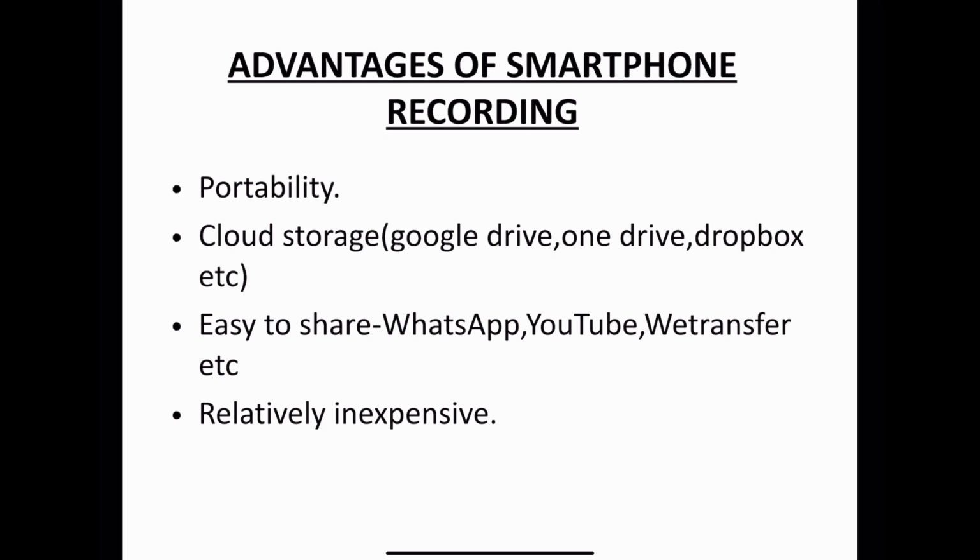Smartphone recording comes with a lot of advantages. The biggest advantage is the portability. The second big advantage is the cloud storage that these smartphones provide. You can upload your files on Google Drive, OneDrive, Dropbox, etc. They are easy to share, example on WhatsApp, YouTube, WeTransfer, etc. And the whole ecosystem is relatively inexpensive.